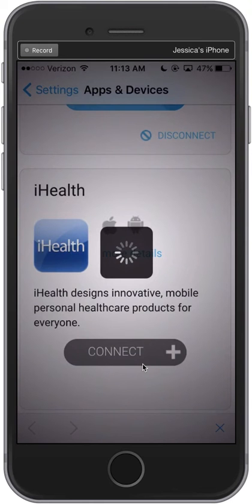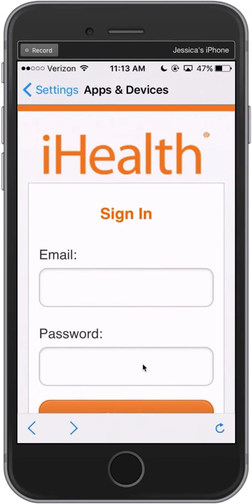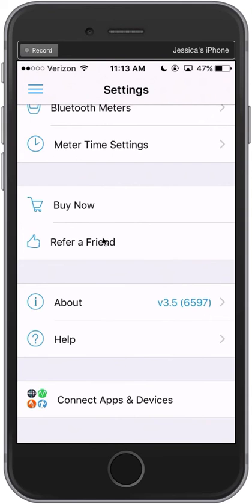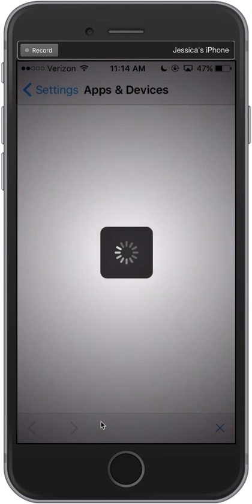Some apps may require you to enter login information before completing the connection. When you've successfully connected, you will see Connected displayed next to the app.